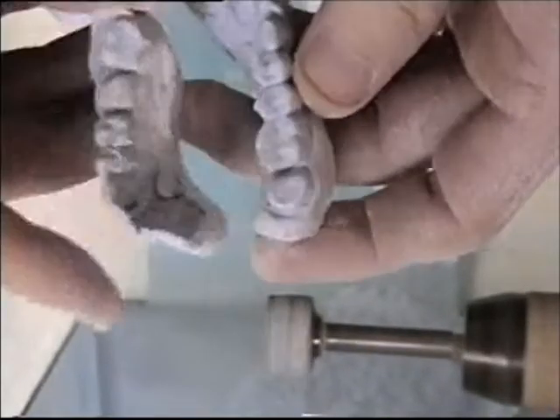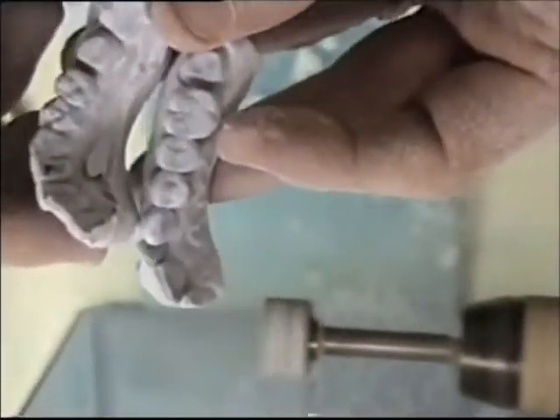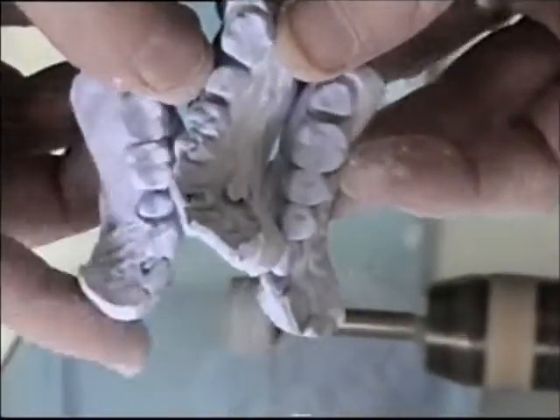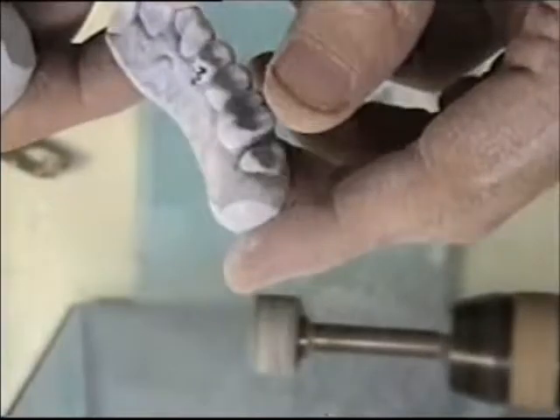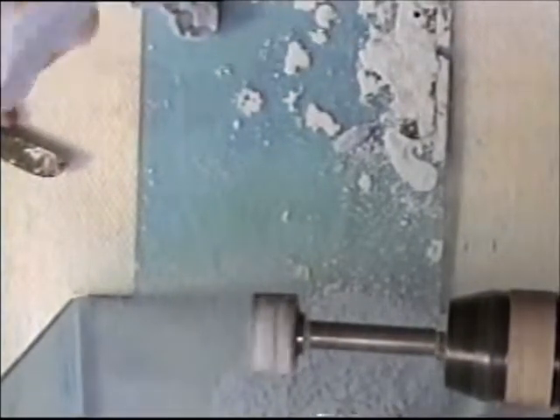Okay, that's all I need to do there. Now I will brush this off and clean them up under water and move on to where we will set our dowel pin holes into the bottom of these die models.